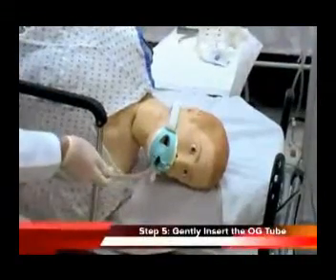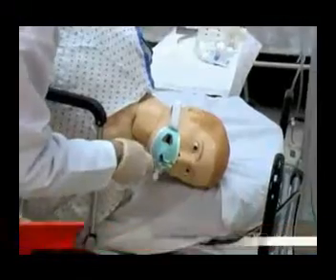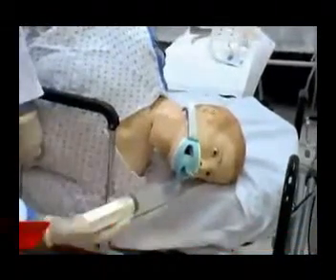Step 5. Pass the tube gently into the esophagus. There are cases of esophageal perforation from OG tube placement, so don't get too aggressive. Step 6. Verify tube placement with insufflation. You do not want to fill the patient's lungs with fluid.